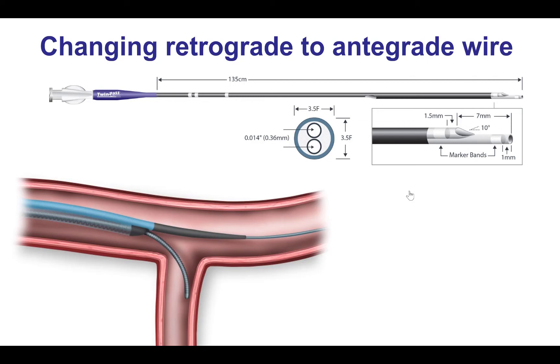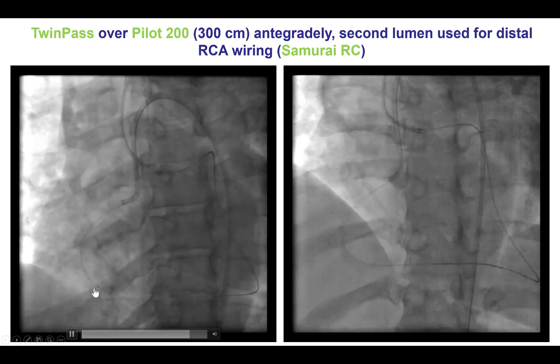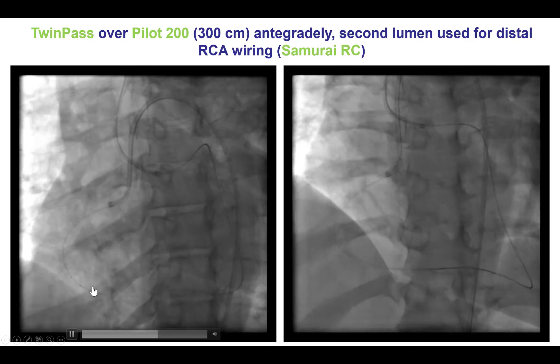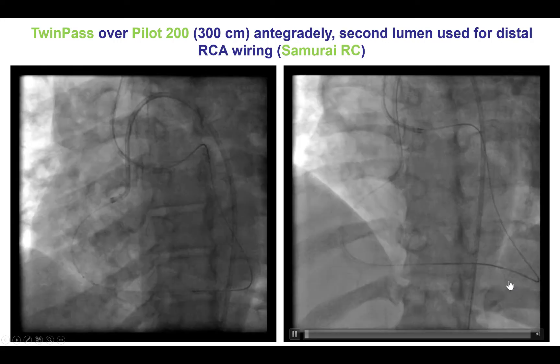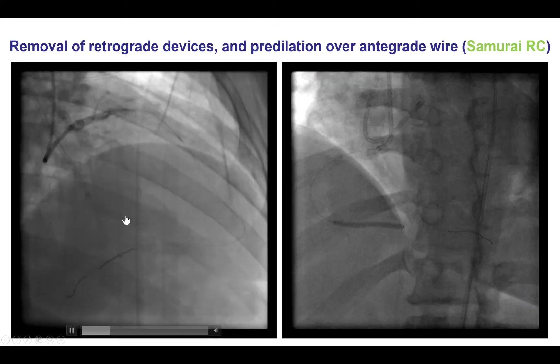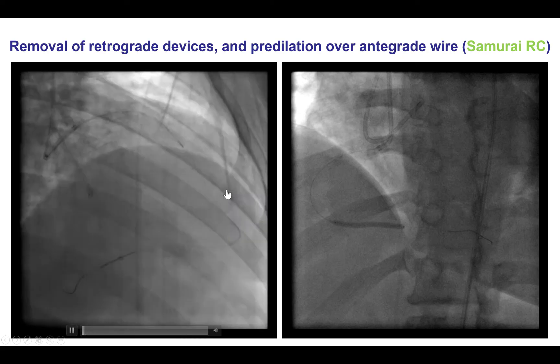We wanted to remove the retrograde gear soon because of tension and straightening of the epicardial collateral. The best way to do this was by using a dual-lumen microcatheter, such as the Twin Pass. The dual-lumen catheter is advanced over the externalized guide wire through the monorail lumen, and then the over-the-wire lumen runs from front to back, allowing advancement of an antegrade guide wire. We advanced the Twin Pass over the retrograde guide wire and were able to advance an antegrade Samurai RC guide wire into the right posterior descending artery. We then removed the retrograde gear and confirmed no injury to the epicardial collateral.